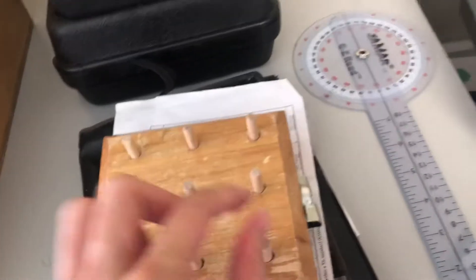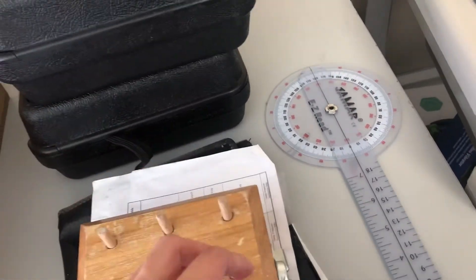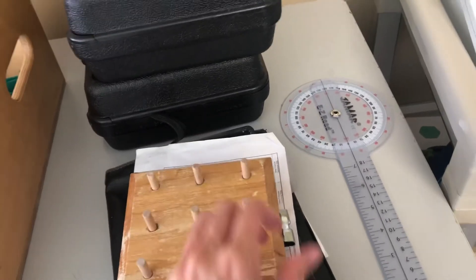And this is the pegboard, where you take these out and put them in the holes as fast as you can to test your pinch and coordination.